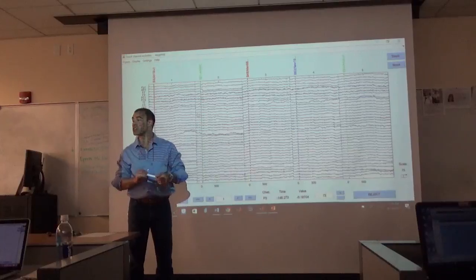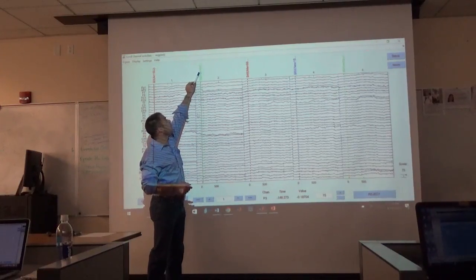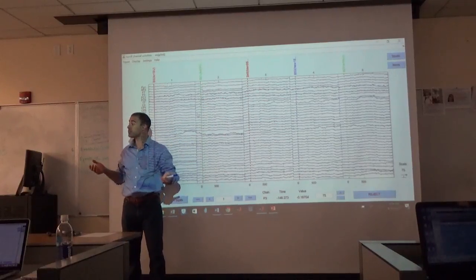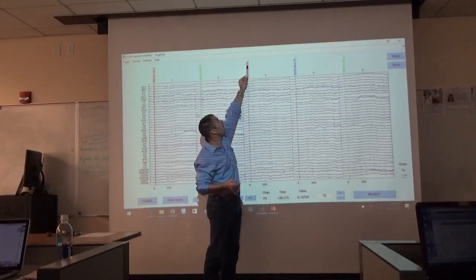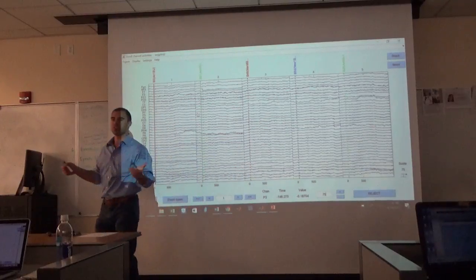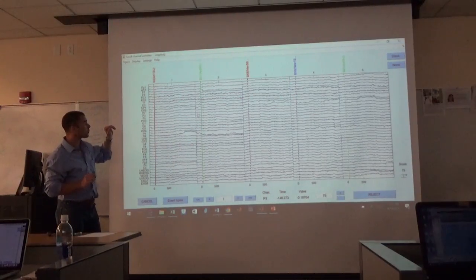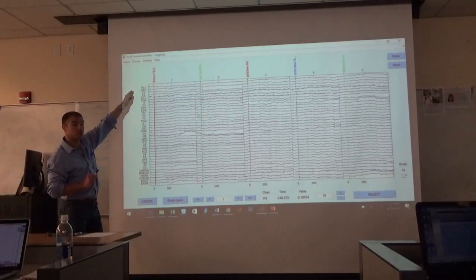And if you want to know what they actually thought on that trial, we have animacy, AN, item judgment was a 5, and their source judgment said SC. That meant it was source correct. Here it was a man-made condition. They said 5, and well, you can't see the rest of it, but it'll tell you what their source is. But the point is that it maintains the information for you. Okay, so we have our 5 trials, and they're numbered. They're also coded for what they are.